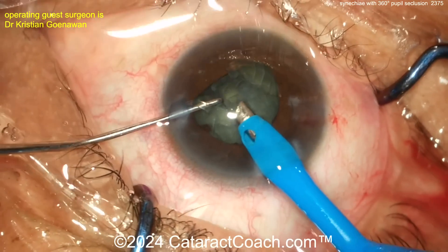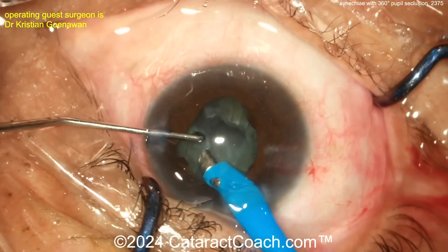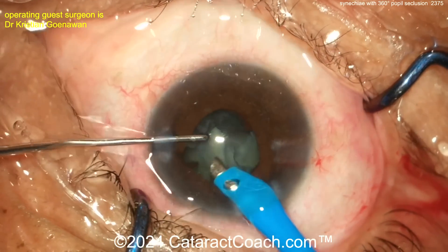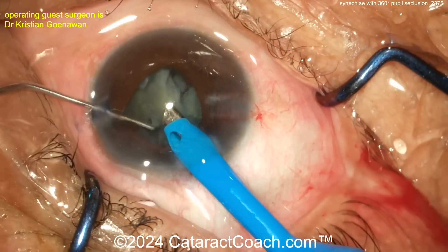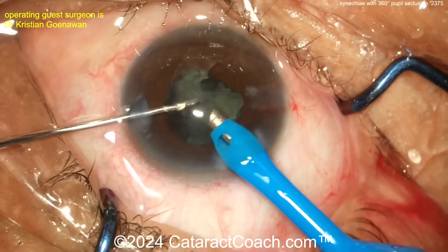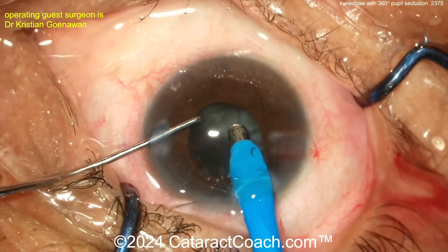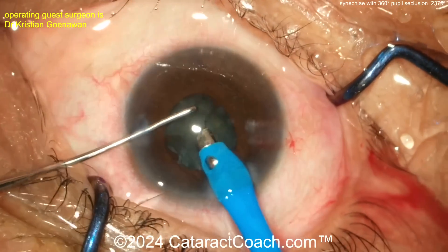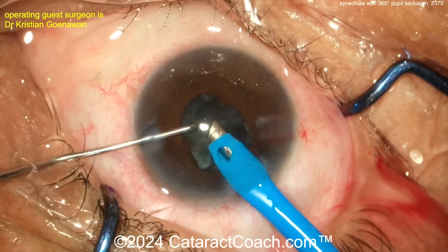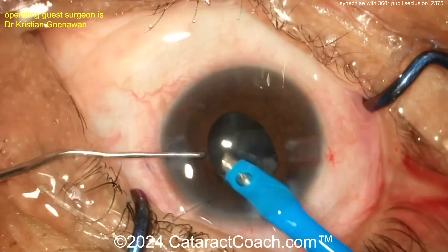Beautifully done — a tilt and chop, getting the nucleus partially prolapsed up. There's probably enough anterior chamber depth to accomplish this nice chop technique. Get those pieces forward. Imagine once you get this big bulky cataract — probably four-and-a-half millimeters anterior-to-posterior thickness — out of the eye and replace it with a thin IOL: you'll get nice deepening of the anterior chamber. You're also unlikely to get further posterior synechiae on a hydrophobic acrylic lens. Another reason to avoid a baby rhexis is that it could re-synechiae to the anterior capsule edge.